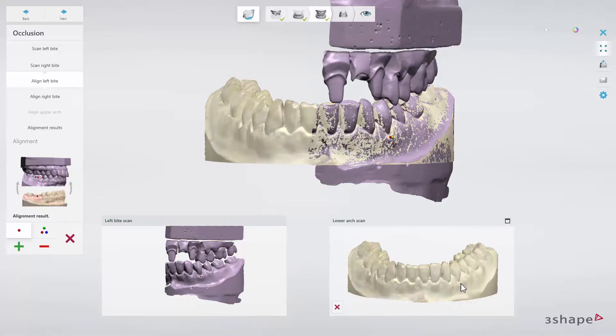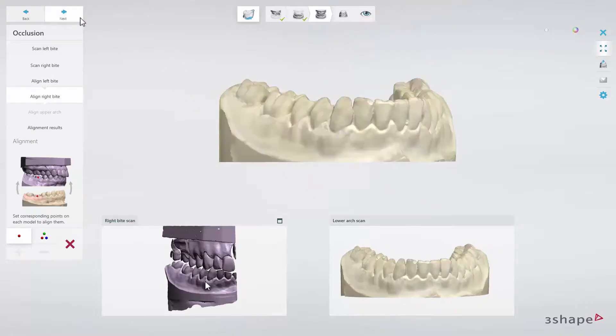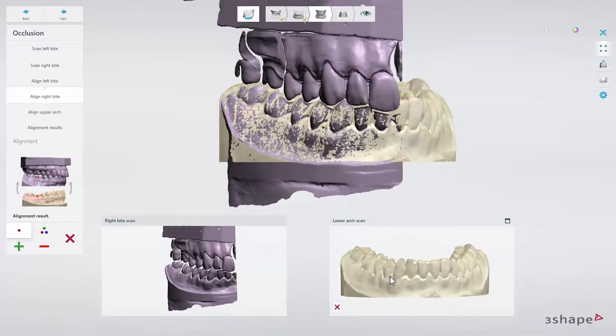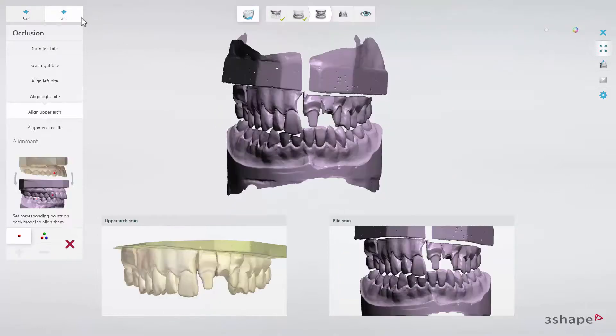When the alignment of the left side bite has been performed, click Next to align the right side. Follow in the same way as on the left side. When the alignment of the lower arch is ready, proceed by clicking Next.